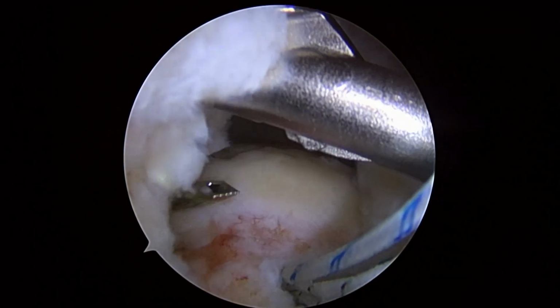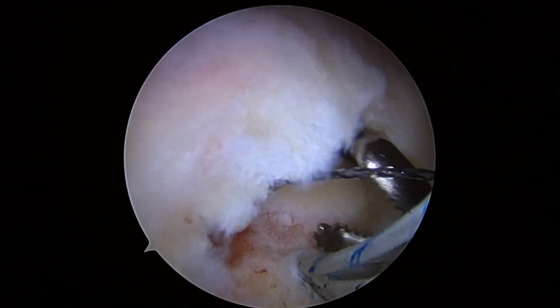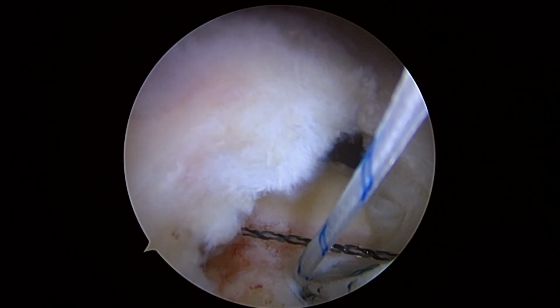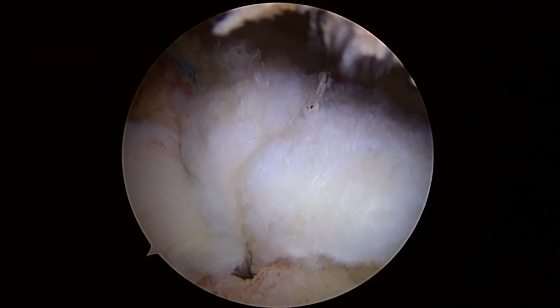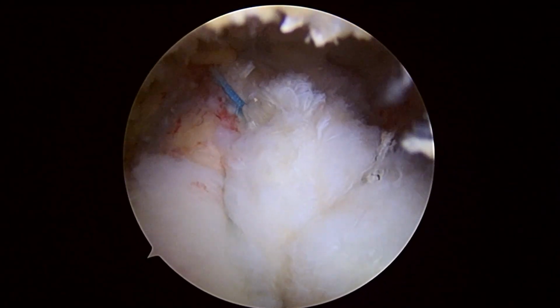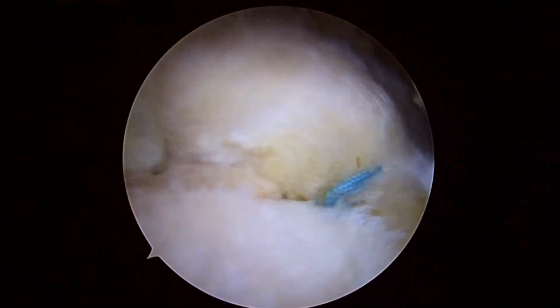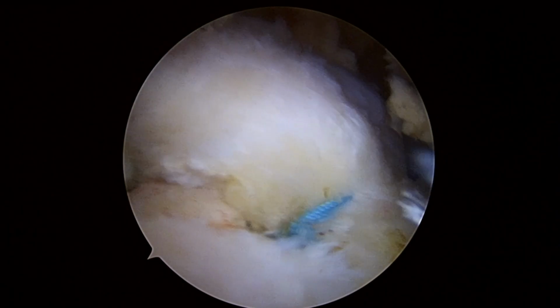And there you can see the hook coming underneath. We'll go ahead and feed the relay, and then we'll start passing these sutures. We'll show you some more in a little bit. Okay, so we're just about done now. We've got 3 sutures tied from one anchor for the cuff. We've got a biceps tenodesis anchor right there.